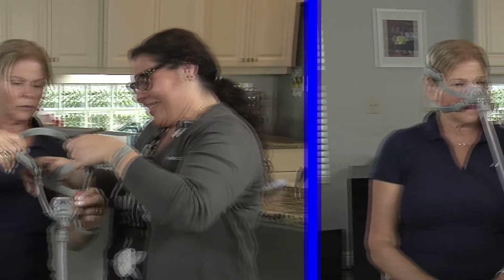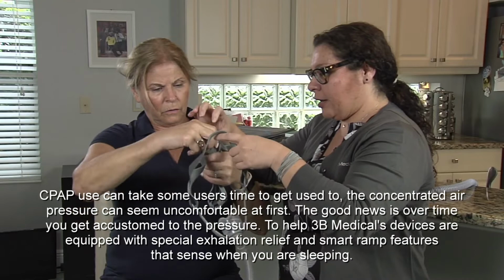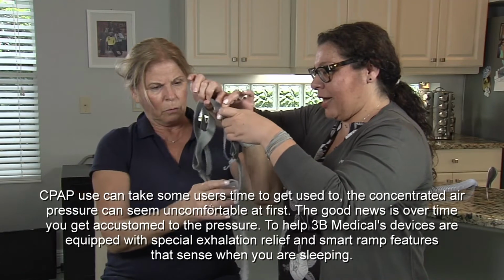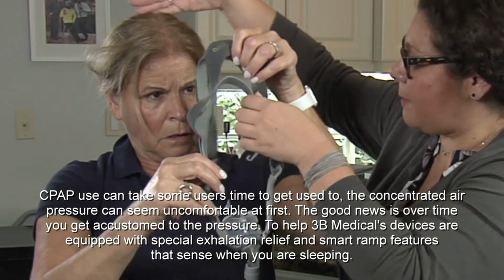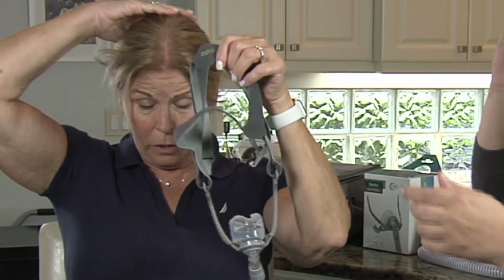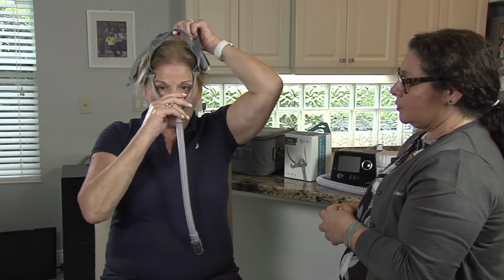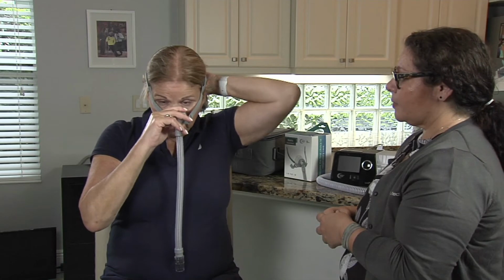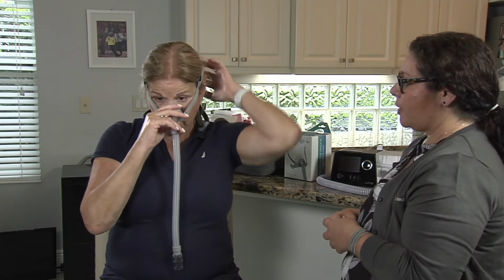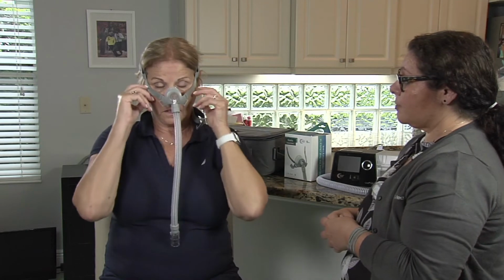Did it contain it? It did. That's okay. So you want to, like, the bottom has the wording on it. So if you want to just kind of hold it like that. Yeah. And then this strap is going to kind of go over the top back of your head. Like right here? Yeah. Okay. You have your clips on the bottom.